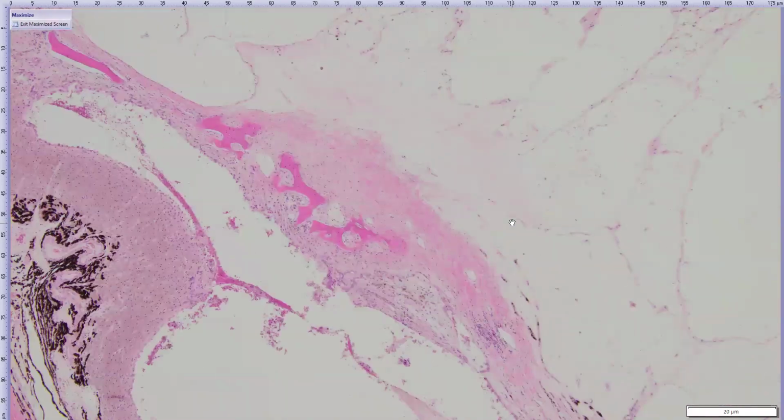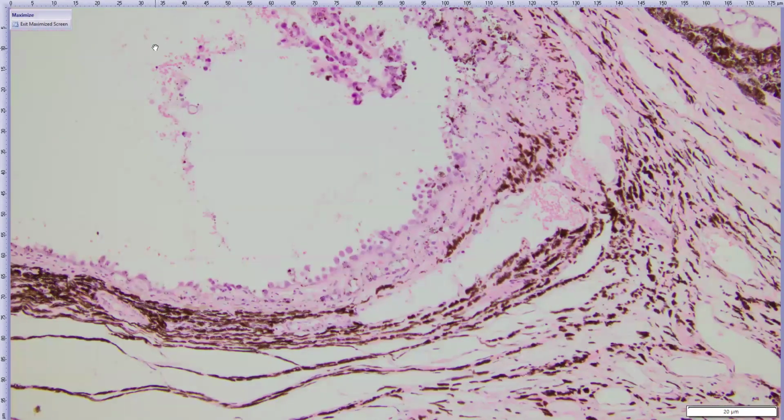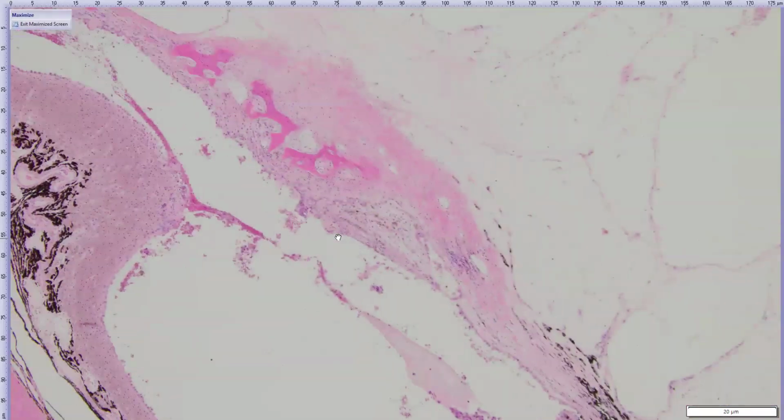And then moving over to our choroid, kind of a similar thing with what was happening with the lens. There's this collagenous tissue that's overlying the choroid, and also some osseous metaplasia within that collagenous membrane. And then just because we have it, with retinal detachment, especially in young cats, the retinal pigment epithelium will become hypertrophied and even somewhat hyperplastic. And we'll also maybe see these papillary formations coming off the choroid. So this is all hypertrophied and hyperplastic RPE, just due to the retinal detachment.